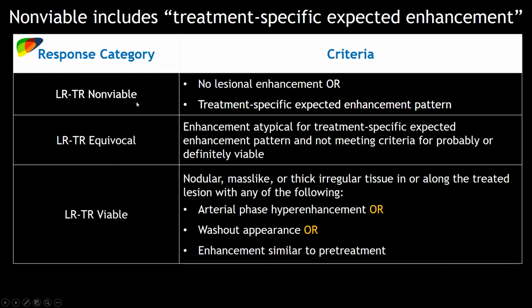Okay, that's why. If we're going to call it non-viable, we have to say no lesional enhancement, and we know that there was enhancement there. So then you're saying, would that be equivocal because it's not that and it's not fitting that? I guess that's a good point, but I think again, because of the type of therapy it was, a non-radiation intra-arterial therapy, and because we're still seeing enhancement, we would call that viable. I don't know if anyone else wants to speak up, Richard or Claude or Victoria.